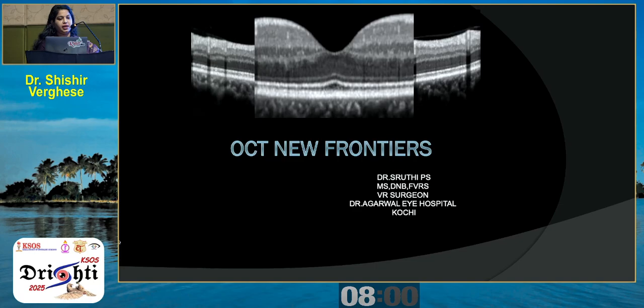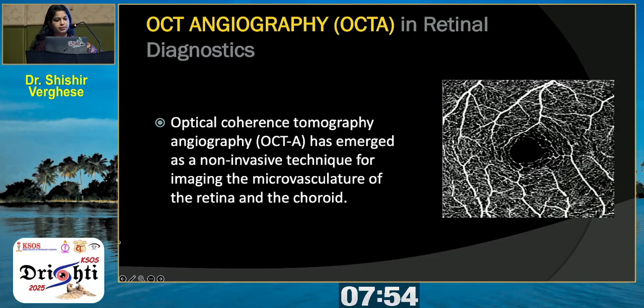So we already learned about OCT in detail. So I am going to talk about what next, what are the available advancements in OCT. So the first one is OCTA. Sir already discussed the OCTA in detail, so I am not going to go into detail about it.